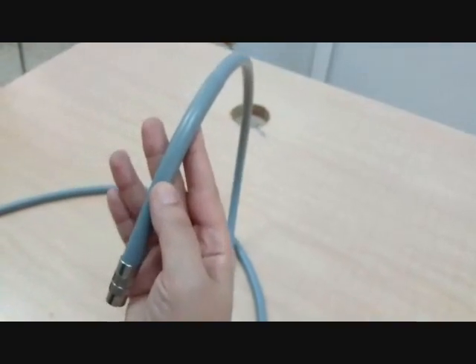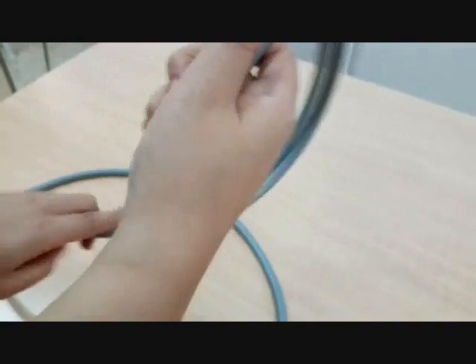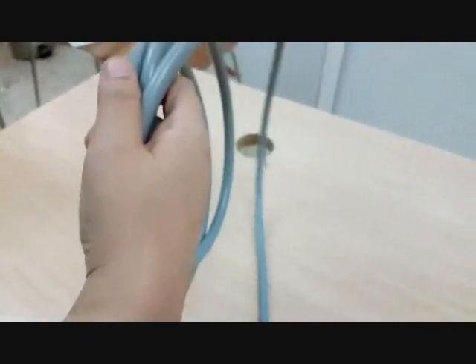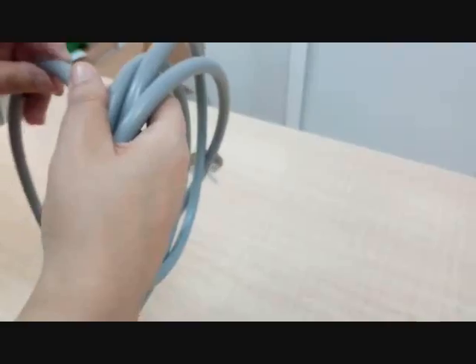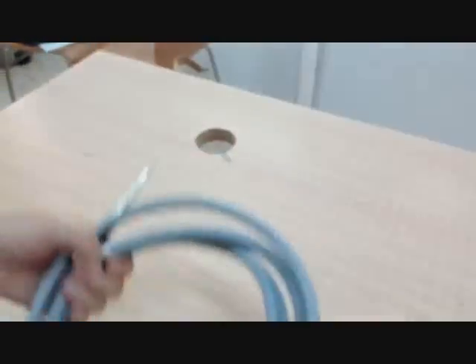Here's how we should wrap the light cable. One circle to the left and one circle to the right. And again, one to the left. The fiber optic light cable is very fragile. We have to watch out for it.